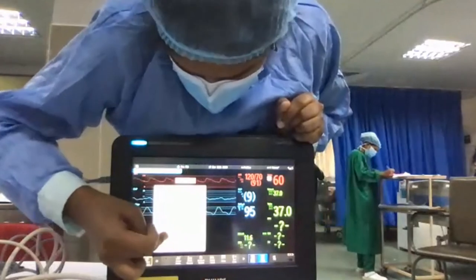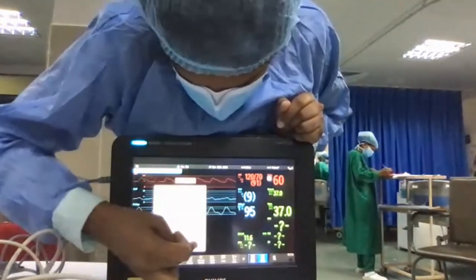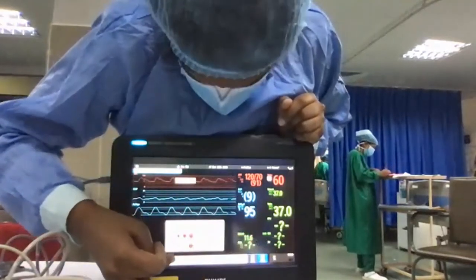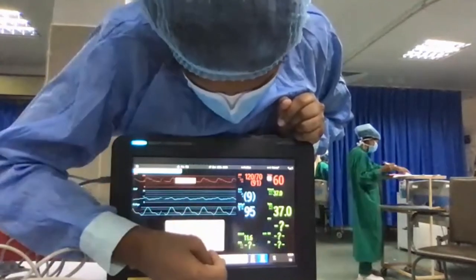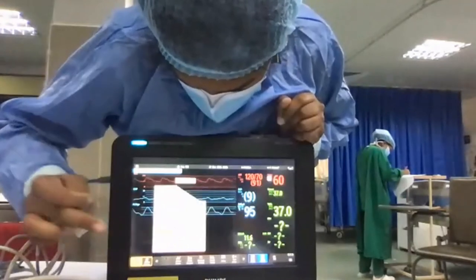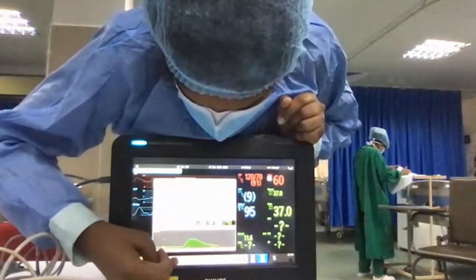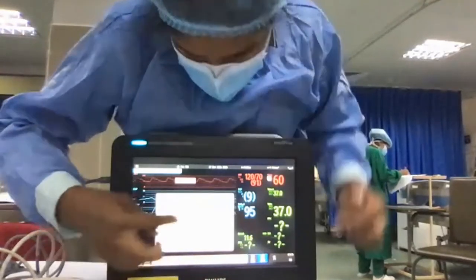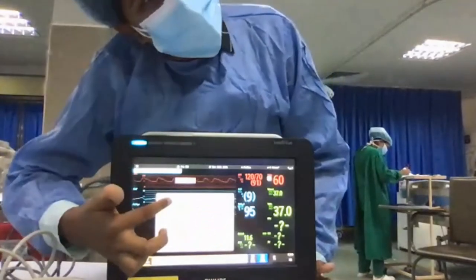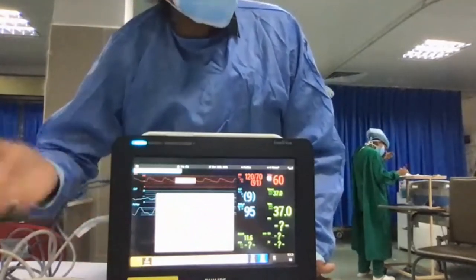Cardiac output setup. CCO. Just to do a resample of vitals. Cardiac output setup. Scroll down. See cardiac output. And here go to hemopulse. What you can do is check here. Now, you are not sure about the values displayed on the monitor, but you can't do a recalibration because it's less than 8 hours.